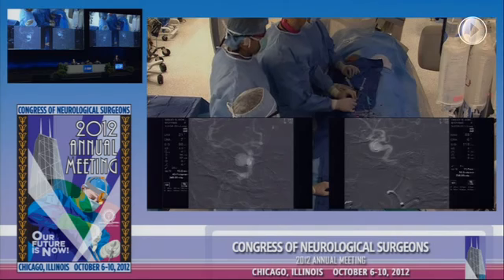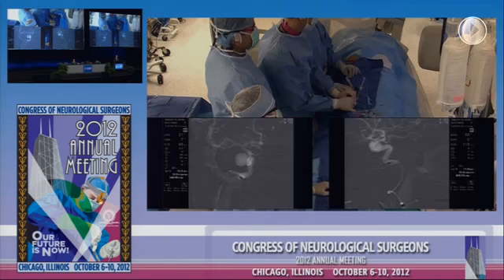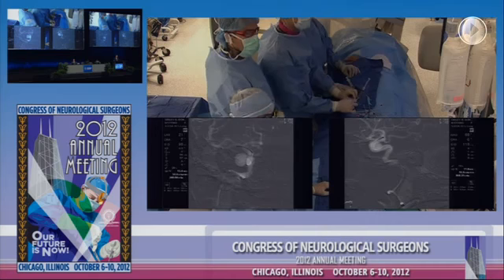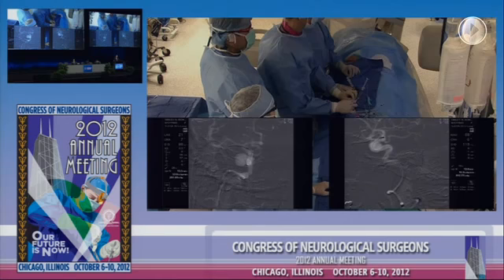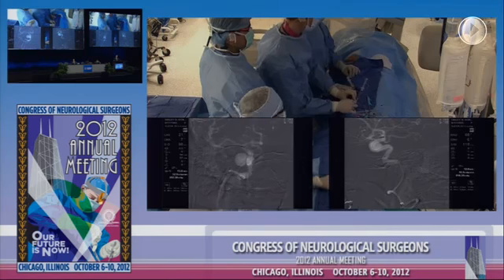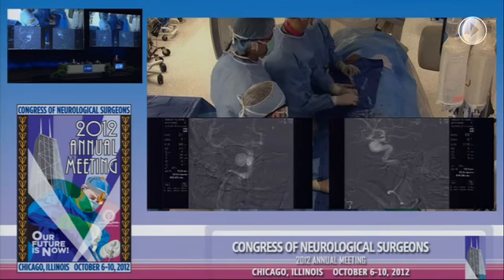And now we can see the lead wire is coming distal to the aneurysm. The nose cone is crossing the neck on the AP and on the lateral. Paul, put in the native film as well up there, AP and lateral? So it's okay. And now we want to be distal to the aneurysm because this has a tendency to prolapse. It's much easier to pull the whole system back than it is to push it forward.